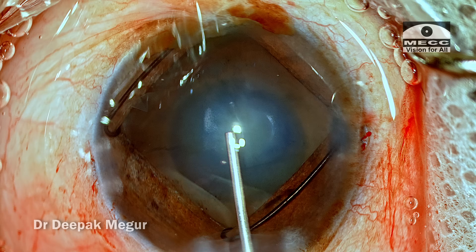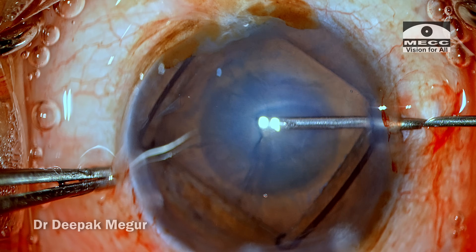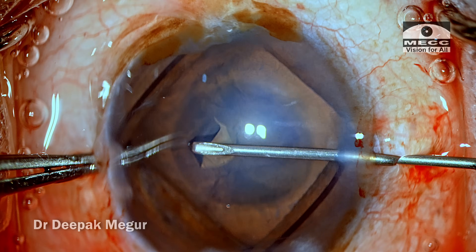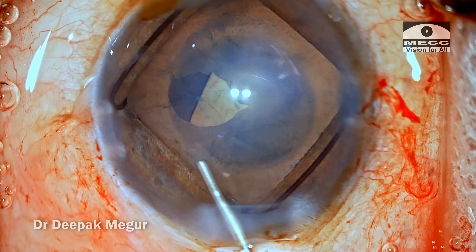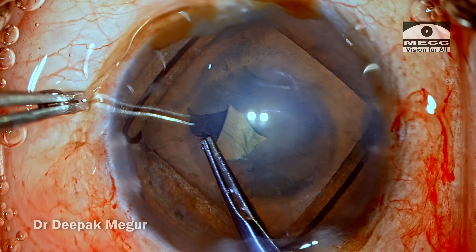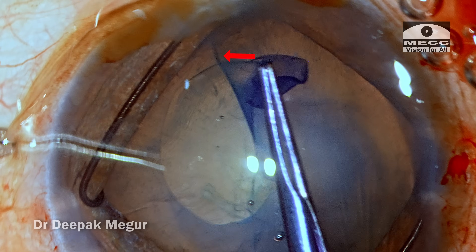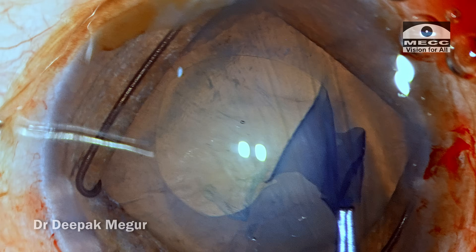Time to perform the rhexis. I'm going to use a new super sharp 26-gauge needle to puncture the anterior capsule because I was not successful with my forceps. The flap is raised and now the rhexis has to be continued with the forceps. As the capsular flap is being torn, please note the folds which are appearing just across the tearing edge, again confirming the sign of significant zonular weakness.